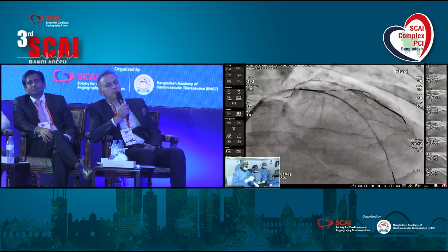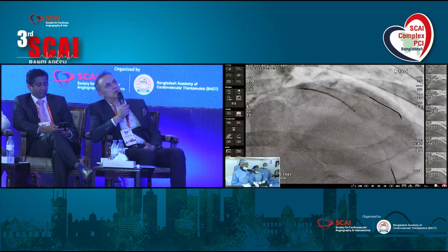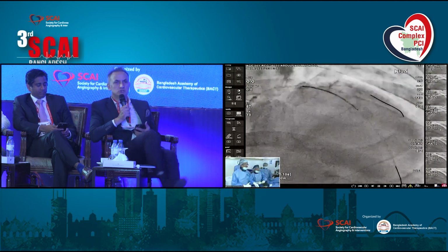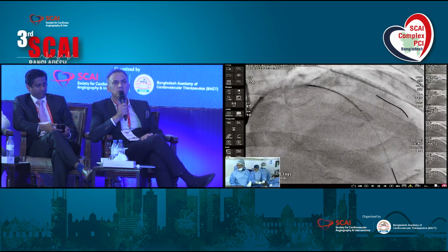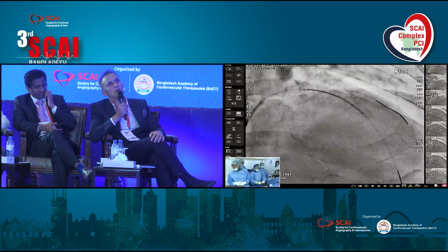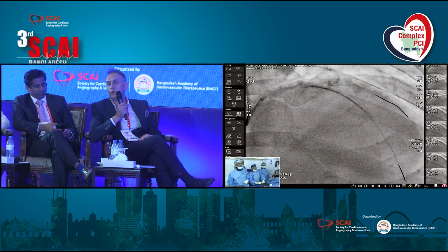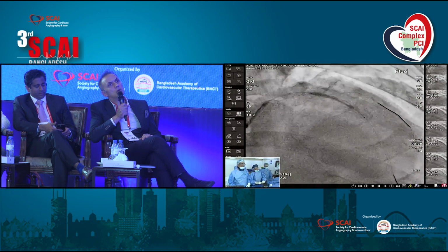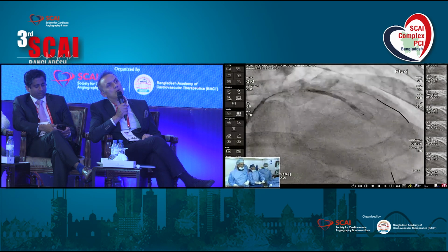Fluoro save that. I think we are missing distally. Begin right there. Sorry, how was the predilatation balloon? How much was the size of the predilatation? 338, and immediately we will inflate up to 7, 8 nominal, and then we shall go further with the post dilatation with a higher size balloon sequentially.